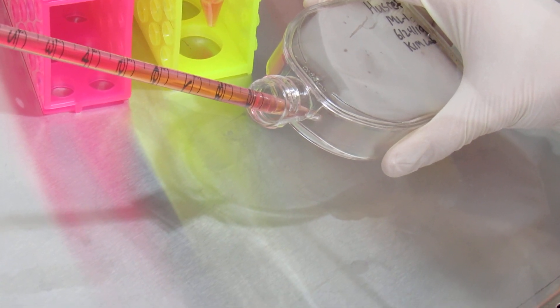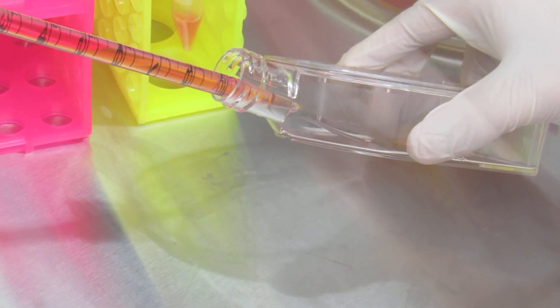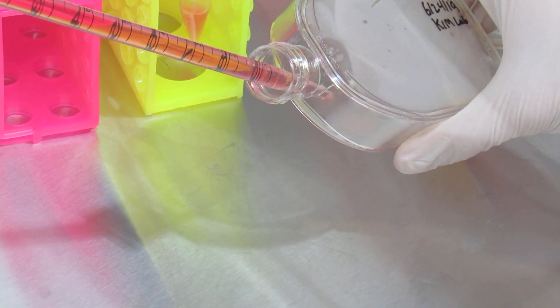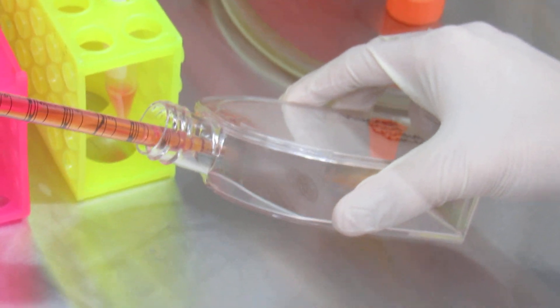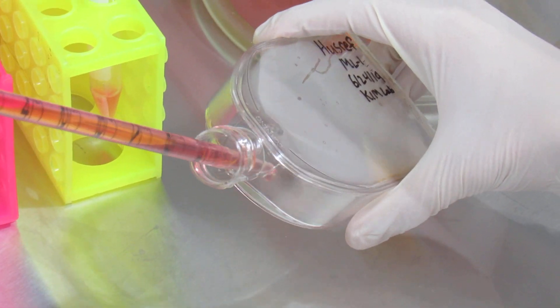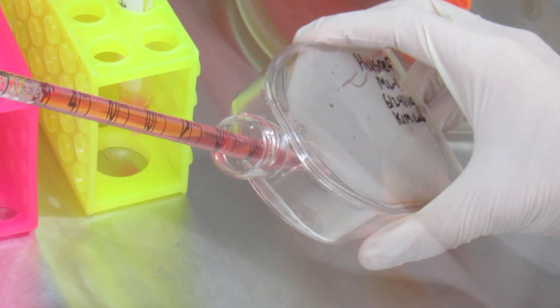After you've successfully added it dropwise, you will pipette up and down to split the cells from each other. So once you trypsinize them, they are no longer attached to the surface of the flask, however they are still clumped together. That pipetting step is what's going to separate them from each other so that you can get an accurate cell count.